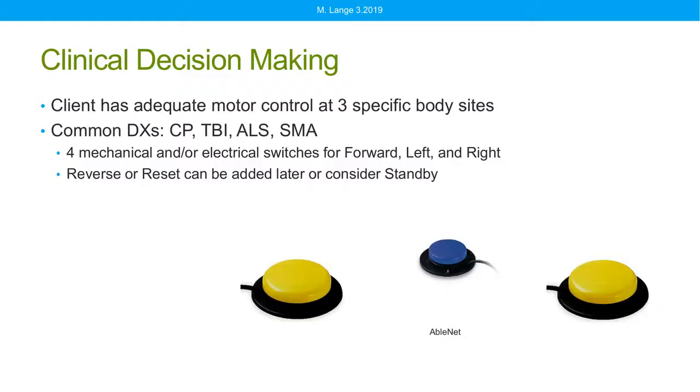All right. So in both of those cases, Faith and Julian, we've used 4 different switches. In Julian's case, there was a combination of proximity switches and fiber optics. In Faith's situation, she was able to use all mechanical switches. But sometimes you might be working with a client where, despite your best efforts, you can only find 3 spots to put a switch. Well, what do we do?